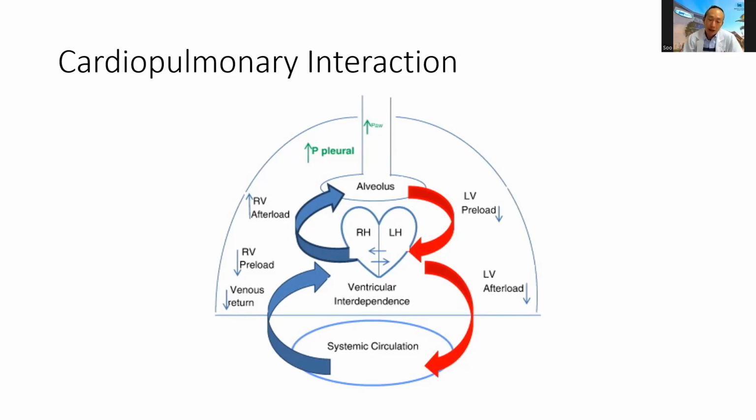So I wouldn't have a great formula for that. But how I deal with it in ICU is that I usually at most go to a 1:1 ratio, and then look at the amount of tidal volume I need, and adjust the length of the I time to be able to achieve my tidal volume. That's what I usually do.